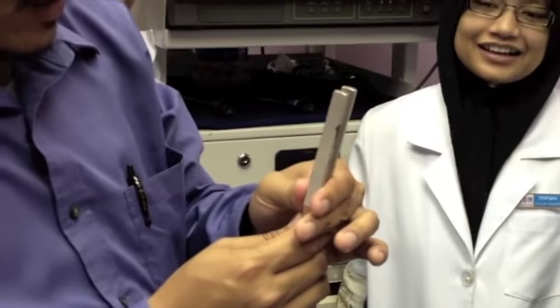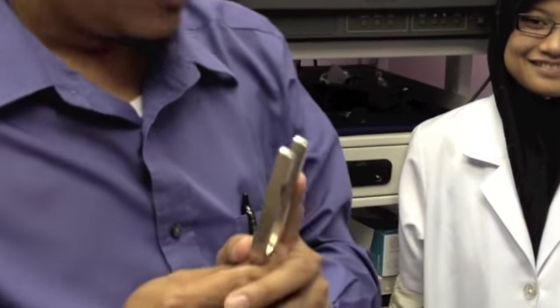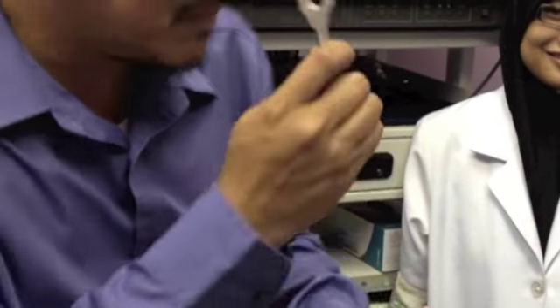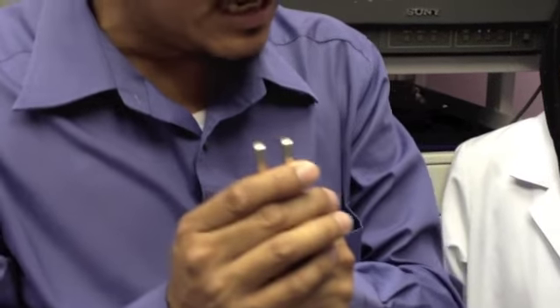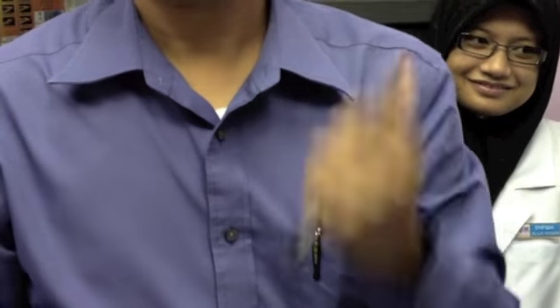Okay, let me explain. There's a simple way to do it. Okay, listen. You do this, okay? Pakcik Amir, saya nak periksa pendengaran Pakcik Amir menggunakan alat ni. Saya akan bunyikan alat ini. Don't say saya akan ketuk, because patient takut. Say saya akan bunyikan alat ni dan saya akan periksa telinga pakcik. Now, you hold like this and you vibrate using only two parts of your body. Only your elbow or the knee. That's all. Don't do anything else.